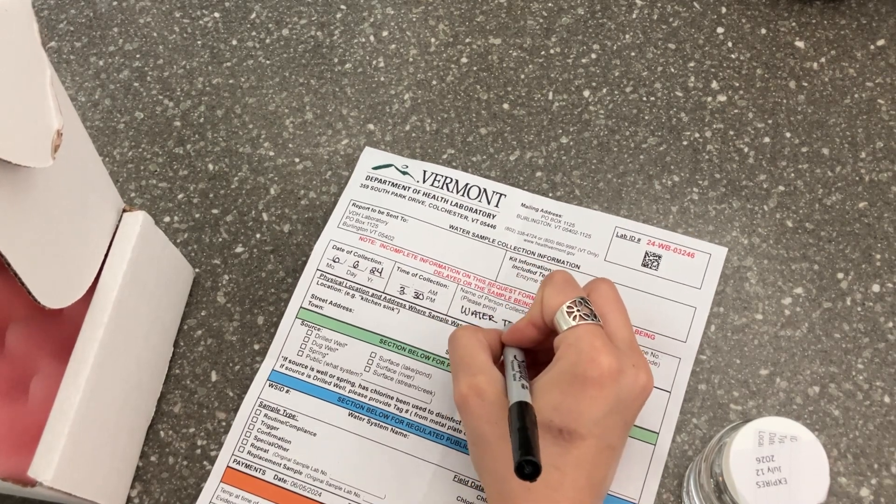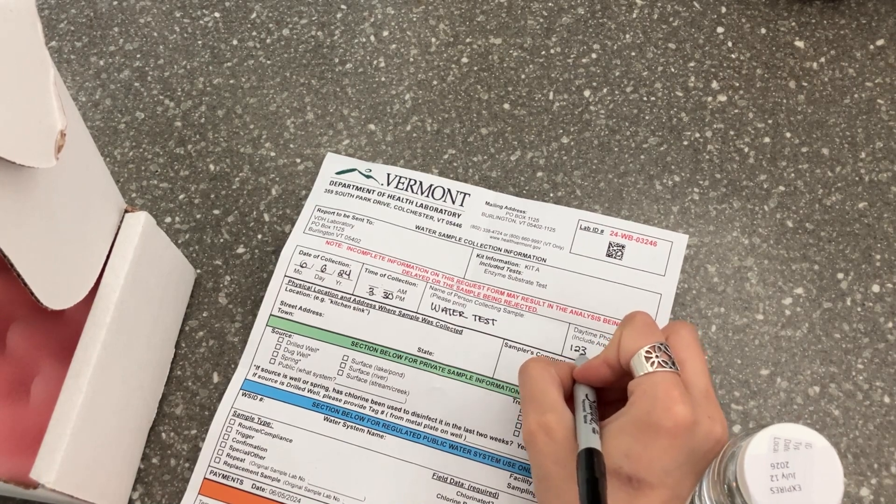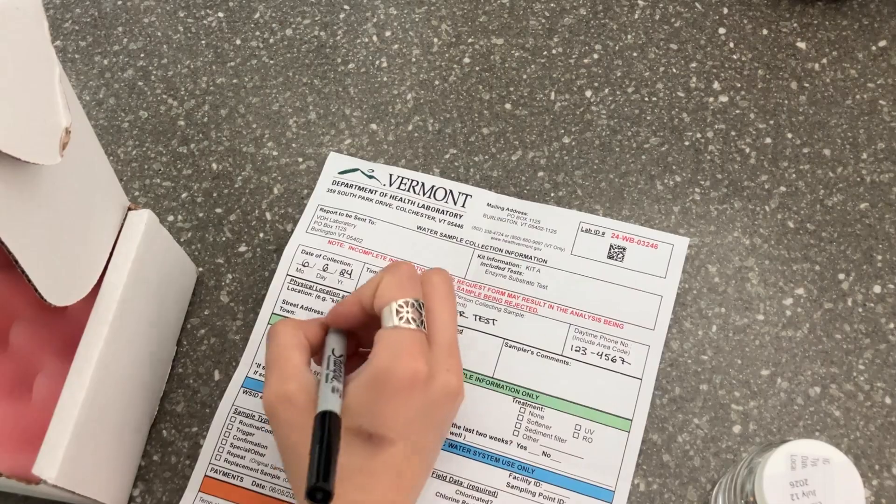Fill in your daytime phone number, which faucet was used, and an email address if you want your results emailed to you. Please note if chlorine has been added to your system in the last two weeks.